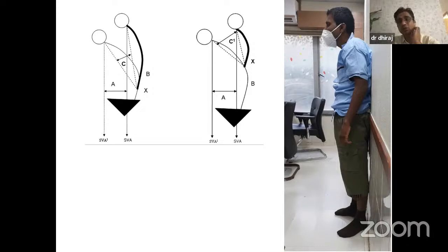I got a very good hold. I could take a hold. I could get a thread in the posterior cortex of the odontoid also. So yeah, I was very confident.